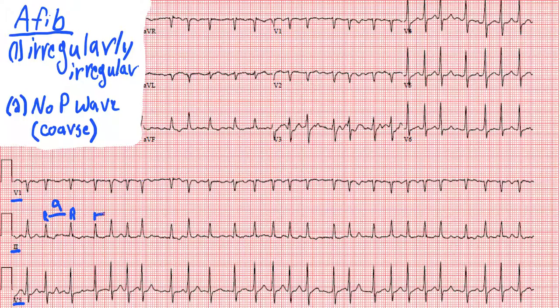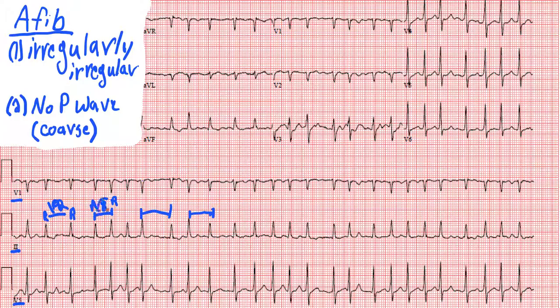This R-to-R over here looks to be about 8 boxes. And you can pick any R-to-R — all of them are going to be different. There's no pattern to the irregularity. It's not like you have 8, then 12, then 8, then 12. They're all random, meaning it's irregularly irregular. We'll erase this here to clear up a little room.